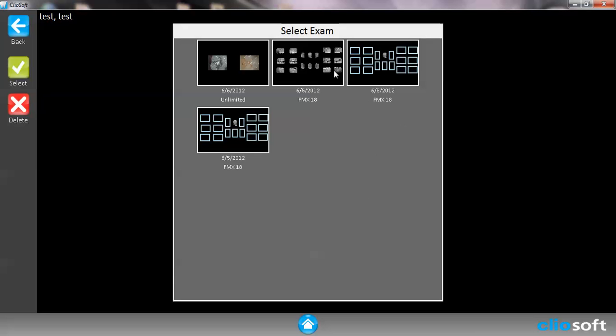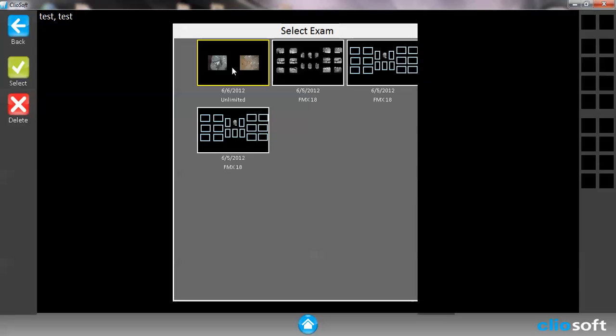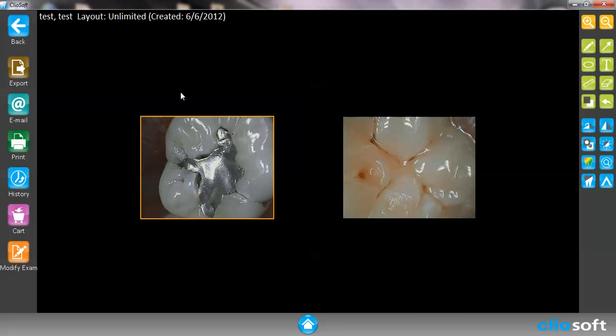So let's go ahead and take the intraoral images first. These are just two of the images I took using our intraoral camera.